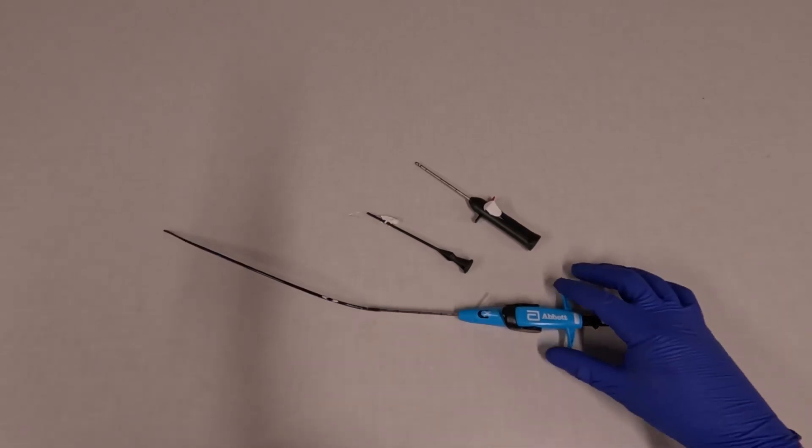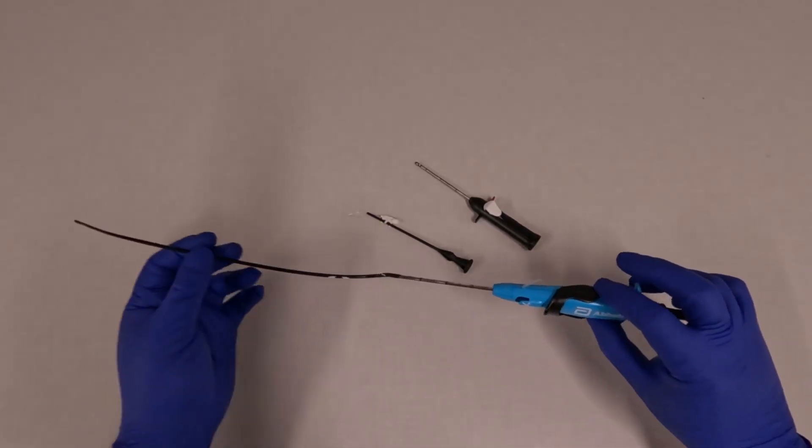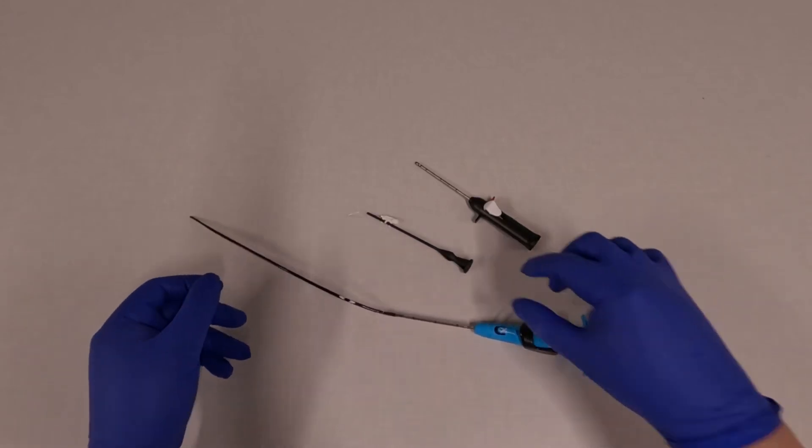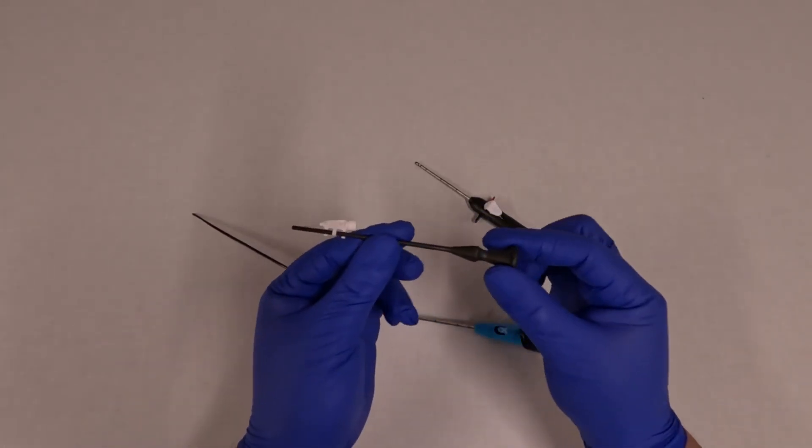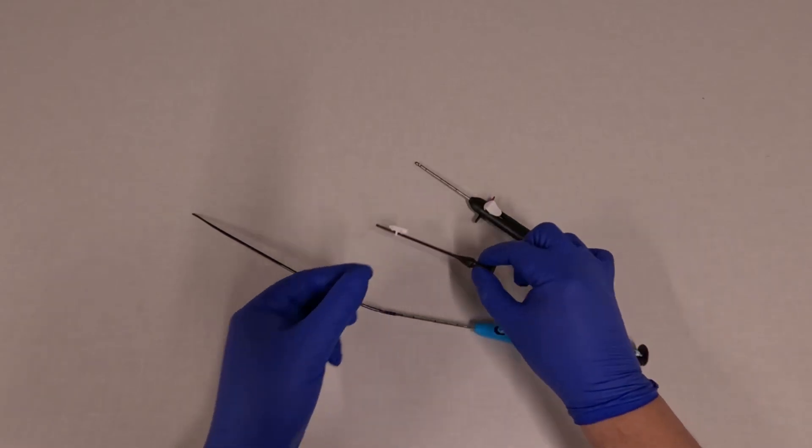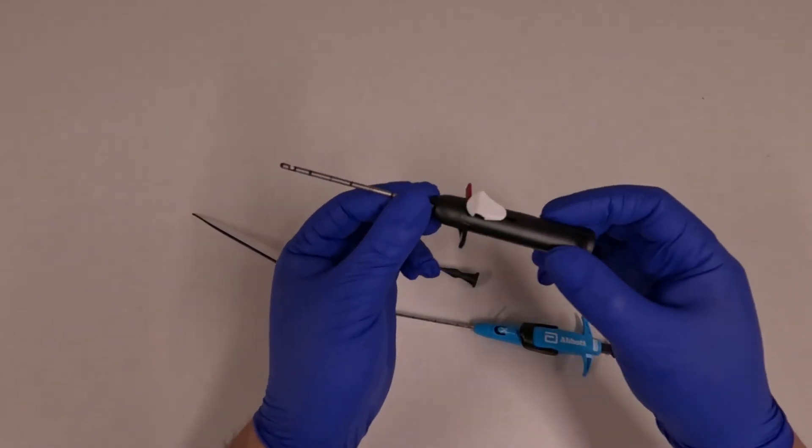When you open the Perclose package you'll get three components. The first one is the device itself, the second one is the suture puller, and the third one is the suture cutter.